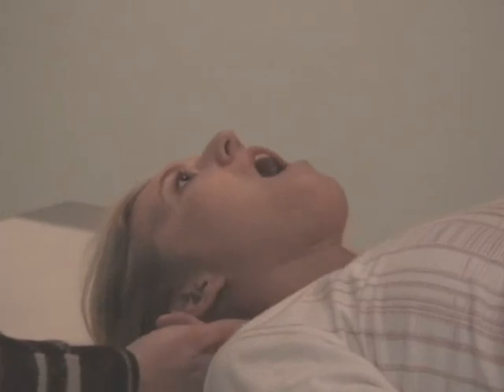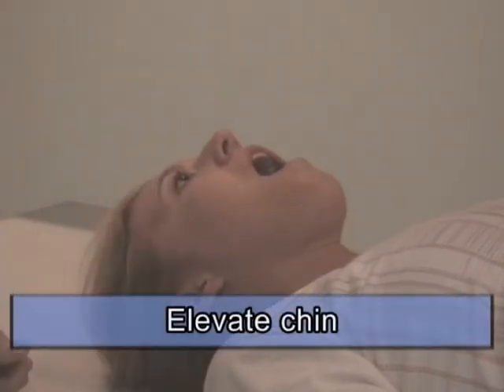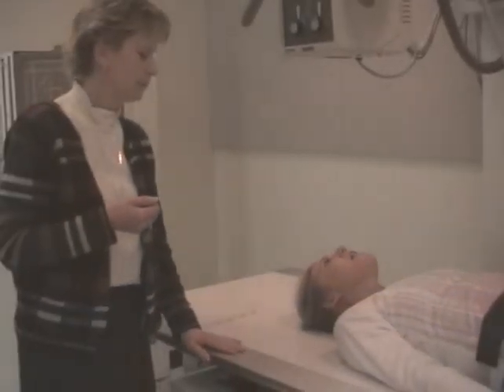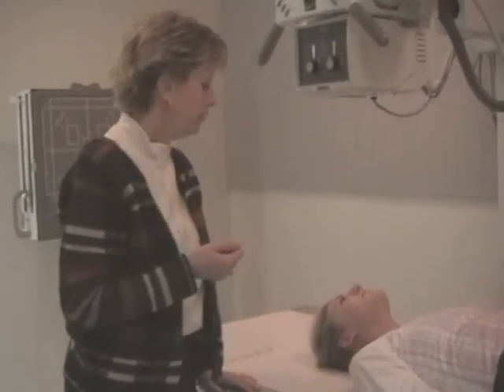Okay? And then on the same token, if you've done it the other way, if the chin was too tucked, like that, the teeth will be lower than the base of the skull, and you have not demonstrated the dens, you need to elevate the teeth. You need to elevate the chin to get the teeth higher to clear the odontoid process. Okay? And then check for rotation.